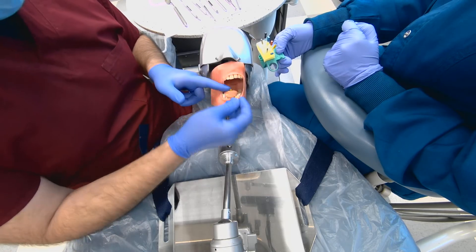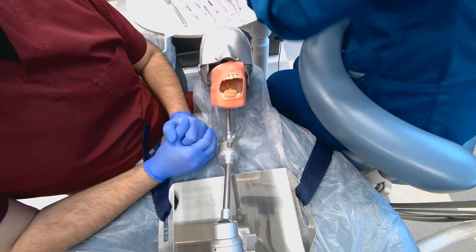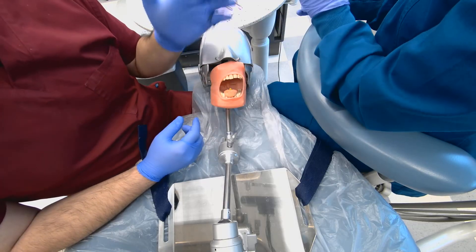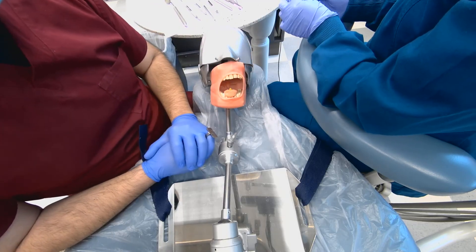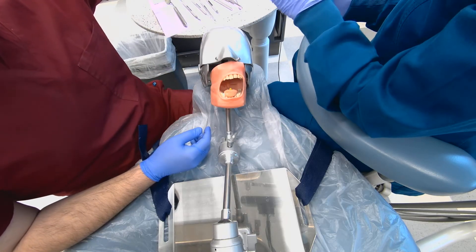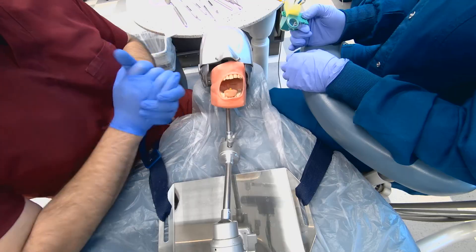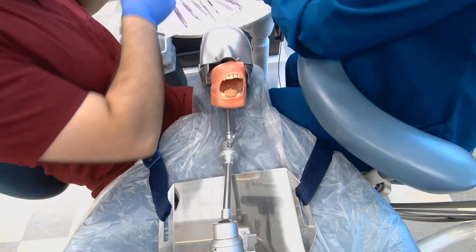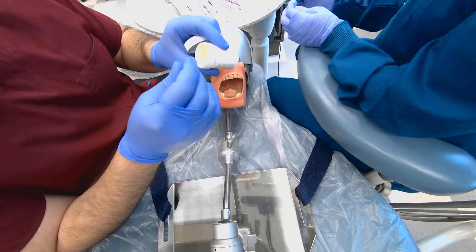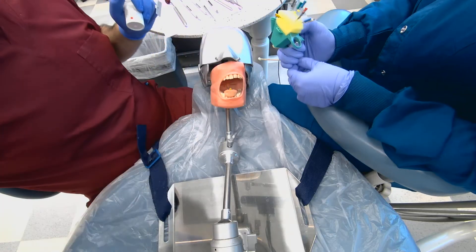The x-ray will show us if the file is at the right measure. Since we have only one canal, we go one file at a time to enlarge the canal until we have clear dentin coming out. The assistant will measure each file and prepare it — we did 15, so we'll do 20, then 25, 30, and so forth. Based on the system we're using, we'll use RC prep to lubricate each of the files. We can also use glide — there are different ways of doing this.